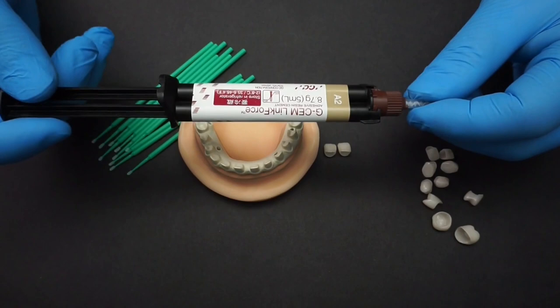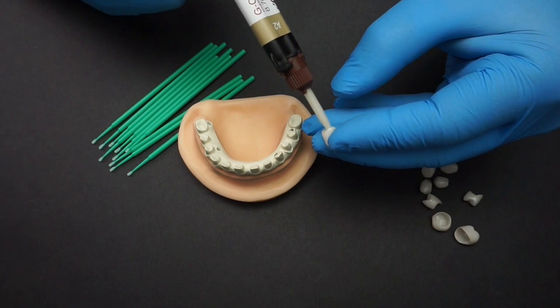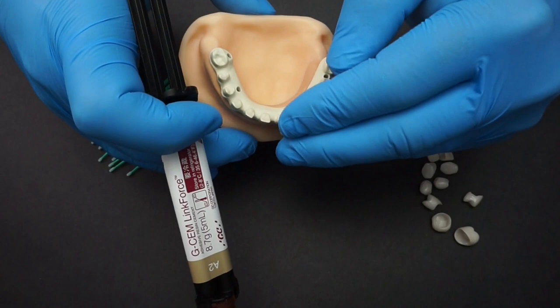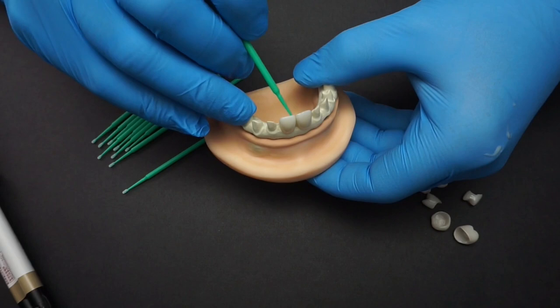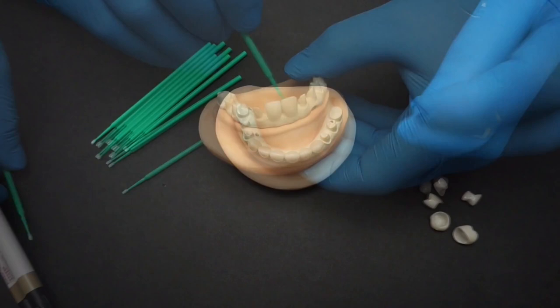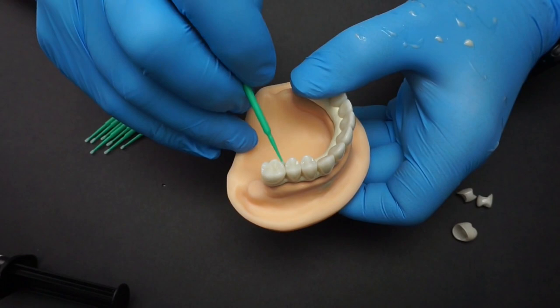For this cementation we're utilizing G-Cem Link Force cement, which comes in three different shades: translucent, opaque, and A2. In this case I'm using the A2. You want to use the tip and apply just enough material inside the crown, spraying it around for a nice proper cementation. I have micro brushes nearby for removal of excess cement — you can never have enough micro brushes. I'm able to use a single tip for the entire restoration since the working time is long enough.